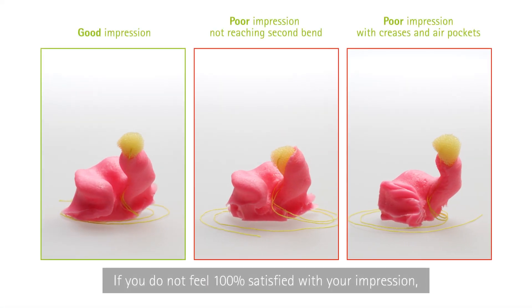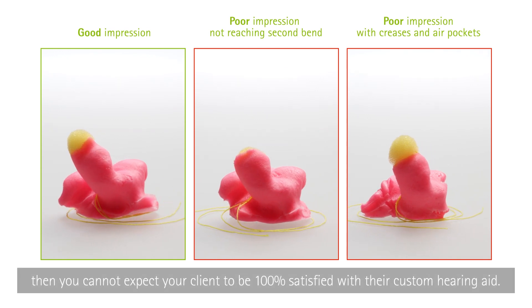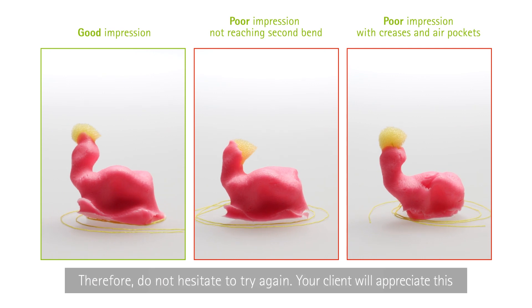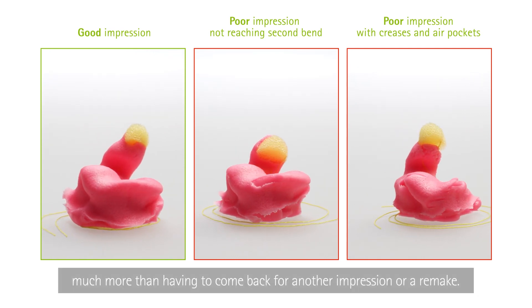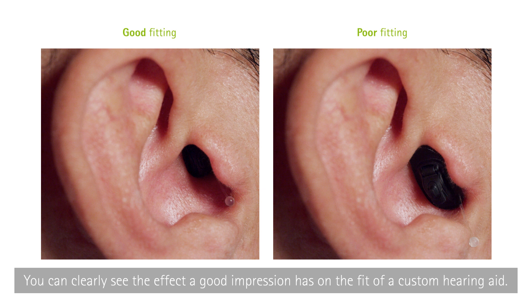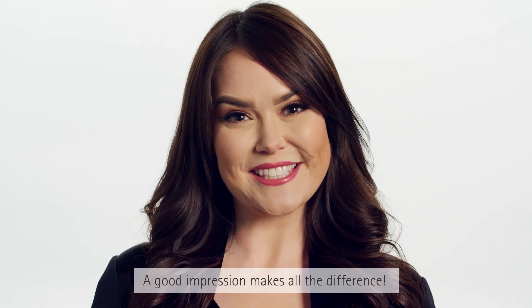If you do not feel 100% satisfied with your impression, then you can't expect your client to be 100% satisfied with their custom hearing aid. Therefore, don't hesitate to try again — your client will appreciate this much more than having to come back for another impression or a remake. A good impression makes all the difference.